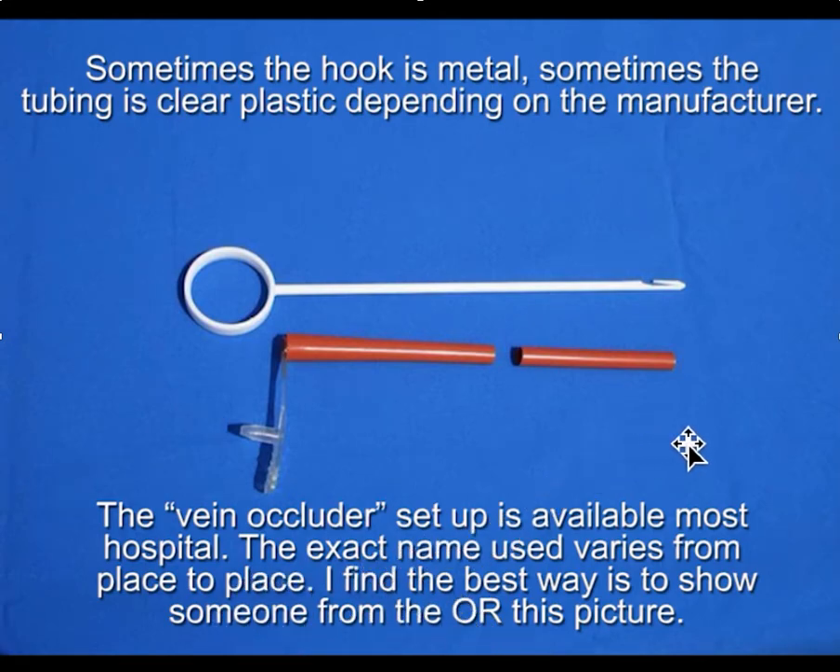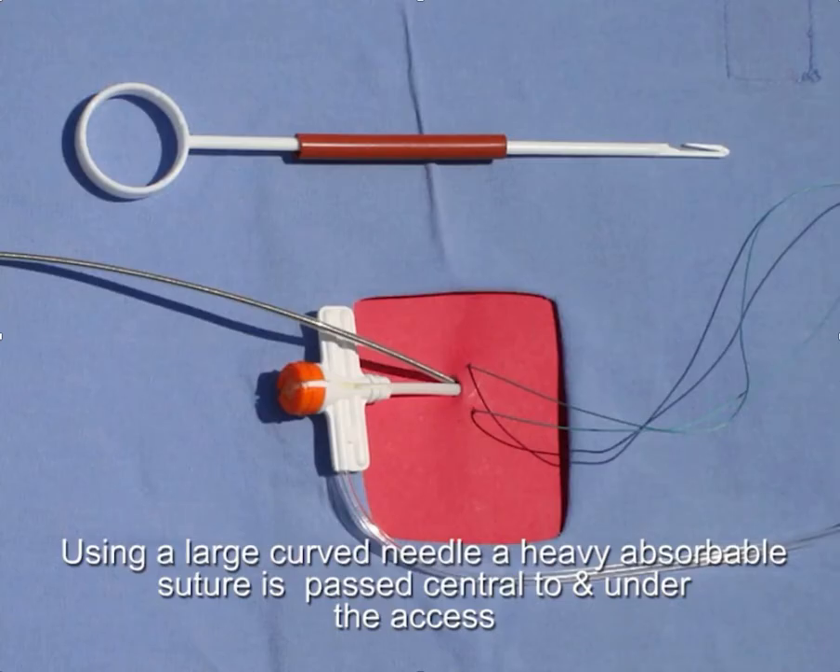If you ever have any question about whether you have these available, the best way is to show a picture of this and say, 'This is what I'd like to have. Do you have this?' — otherwise everybody goes back and forth about what they call it. Without the rubber tubing, you don't get the same level of hemostasis. That's what we refer to as the vein occluder, and it's very helpful when you have high central venous pressure and a lot of bleed back near your access. The most important point is that the suture is central to where the leads enter the vein, passing through the muscle and underneath, so that the suture is being pulled around the exit point.